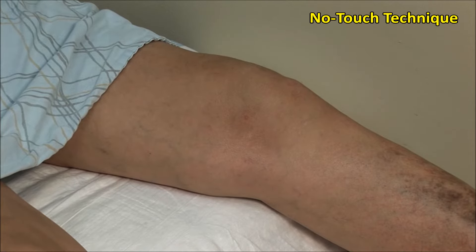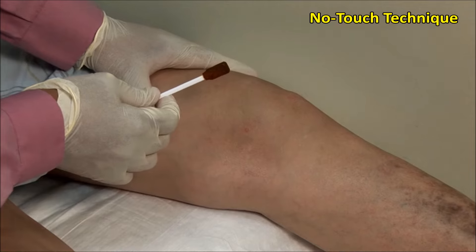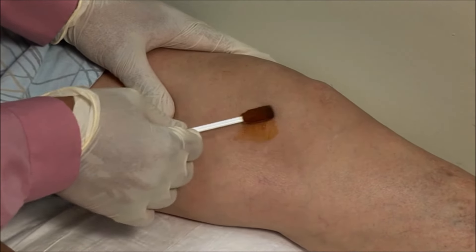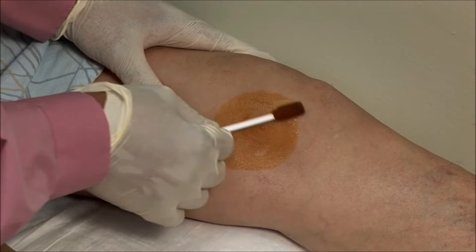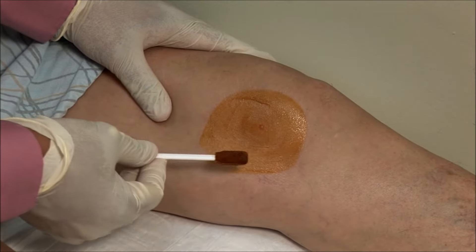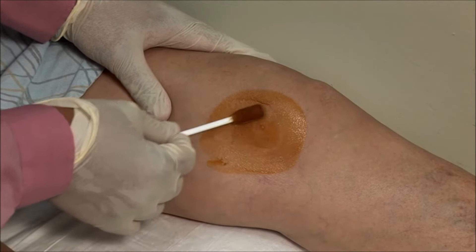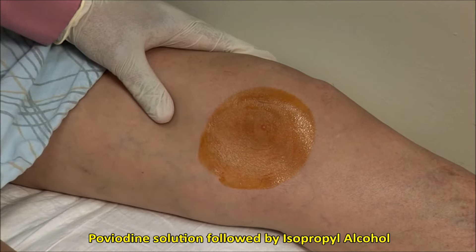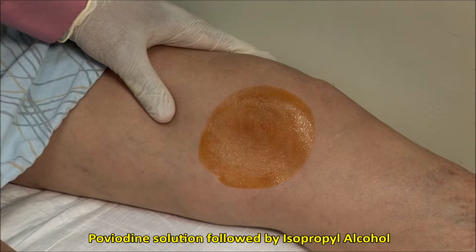These injections should always be done using sterile precautions. A no-touch technique is used, meaning that once the area is cleaned, it must not be touched with anything but sterile needles. Scrub the site of injection and then clean in an outward fashion. Here I am using povidone-iodine solution, followed by alcohol.